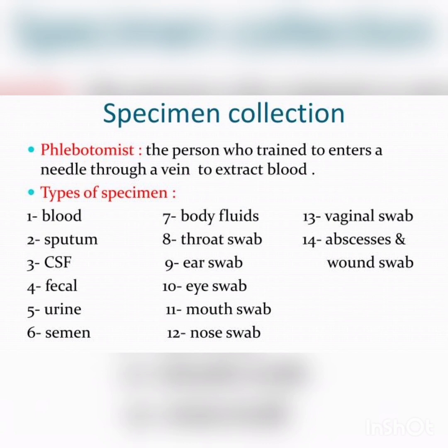On the contrary, clinical material likely to contain abundant microbial flora needs to be kept at 4 degrees centigrade in a refrigerator for several hours. Like urine and feces, they all need to be preserved in the fridge for viability of most of the pathogens. So in case of any delay, that needs to be carried out.